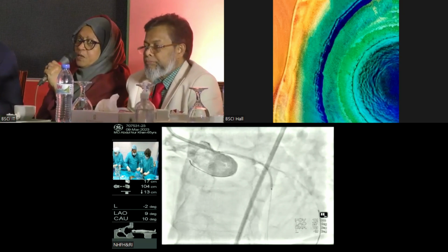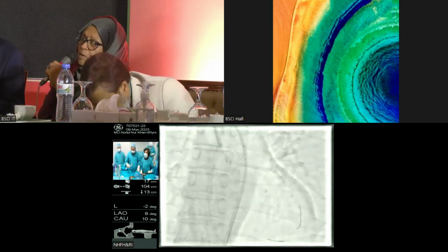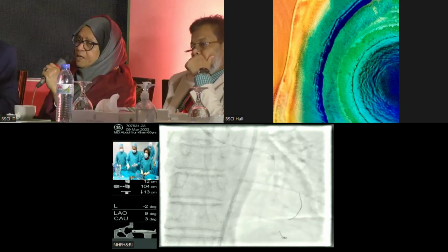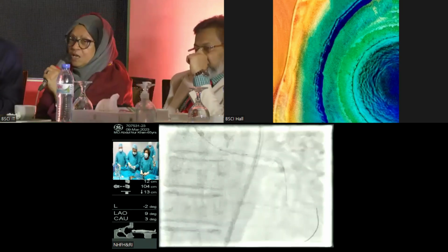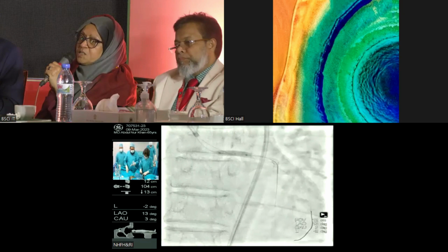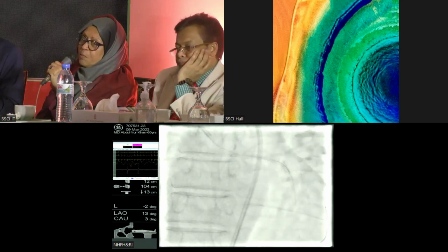The guide depends on the patient, no doubt about it. The lesion and the patient both. If it sits okay, then most of the time it is the Judkins. But even if you use the extra backup, then you have to take it out of the ostia when you are implanting the stent. That can also be done if you know how to handle it, and it's not a problem in expert hands. If you have experience, you feel confident, then you can do it like they are doing it now. So you can use either, but the best is to start with Judkins. If it doesn't go or doesn't fit or doesn't give you the support, then you can take the extra backup.